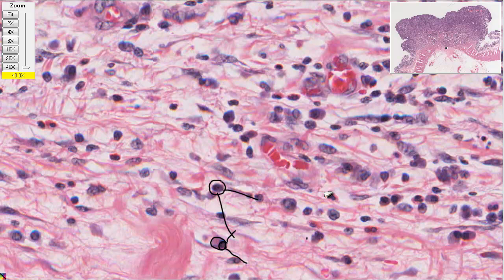That's a plasma cell, making antibodies probably against the tumor. That's the immune response in that spot.